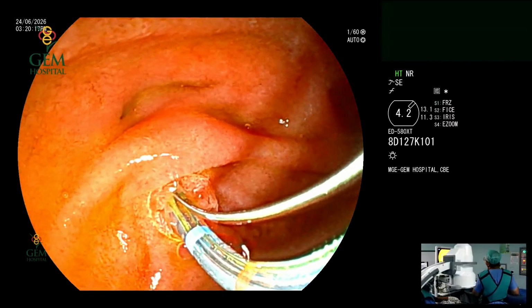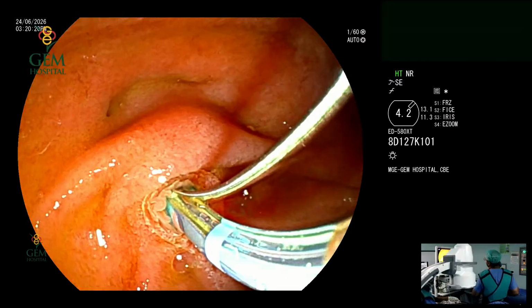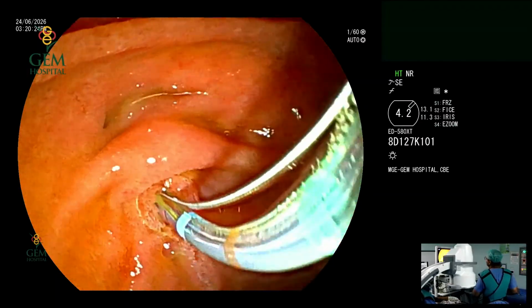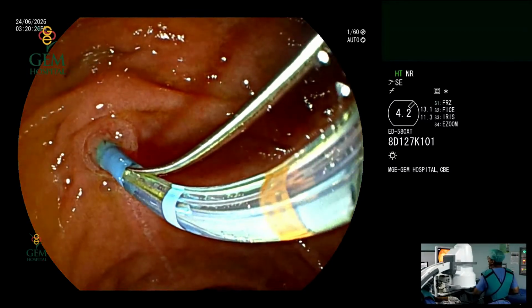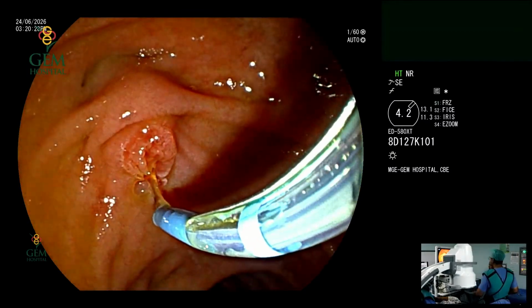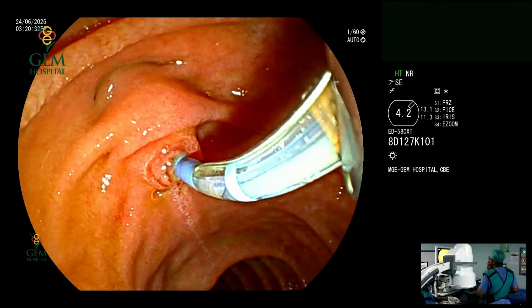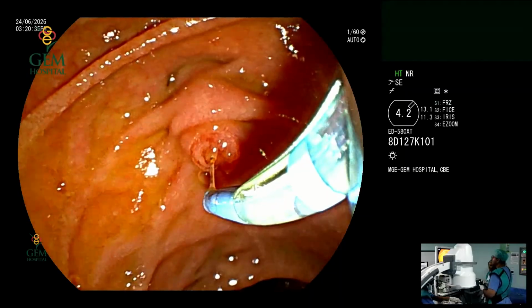I'm changing the right left wheel to facilitate. Can you put? Try. Not working. Okay. I'm removing the bow, please. I'll change the direction. I'll go towards a more likely 12 o'clock position.